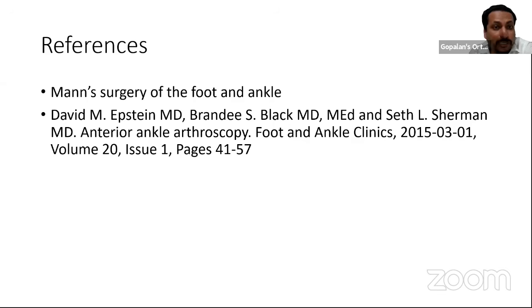As I said in my talk, as it stands, arthroscopy is considered the gold standard to diagnose syndesmotic instability. Okay, thank you for that, Kowshik, because this is a really upcoming area. We've looked at some of the data, and like you said, there's a lot of malreduction, and people have looked at various methods to check intraoperative accuracy of the syndesmosis. One of those is ankle arthroscopy, and another one is intraoperative CT.